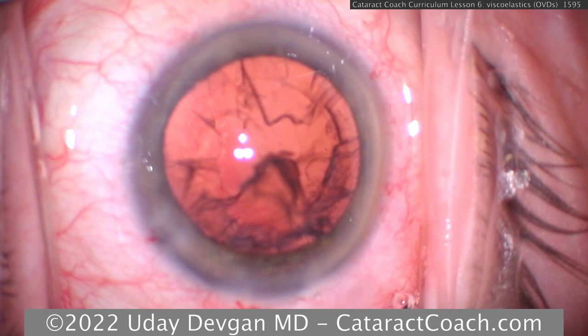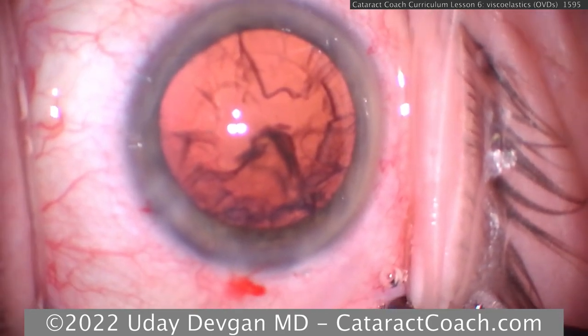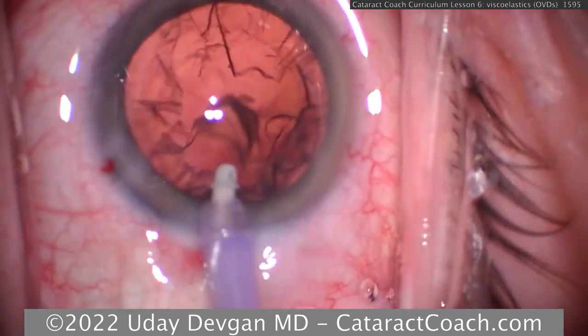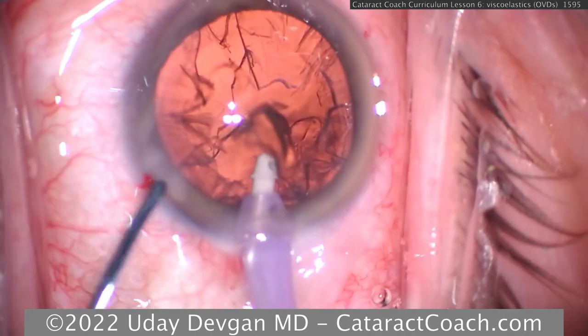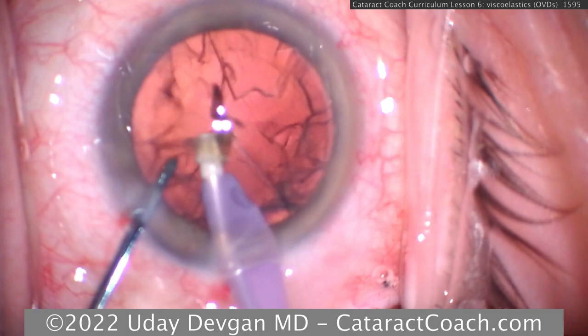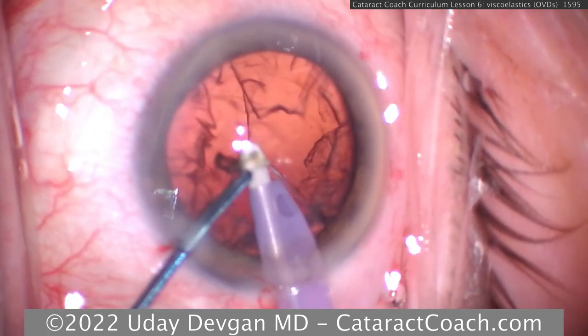They can also be removed very easily. At the end of a routine case, it's nice because you can remove it from the eye very easily because the whole bolus of OVD is cohesive and it washes out. Once part of it is pulled from the eye with the suction tip, the rest tends to follow. Again, examples of this include ProVisc from Alcon, Healon or Healon GV from Johnson & Johnson, and AmVisc from Bausch & Lomb.